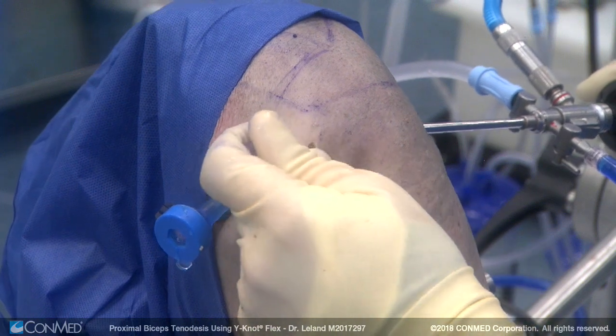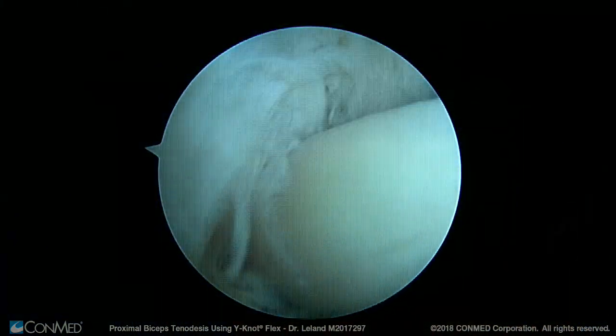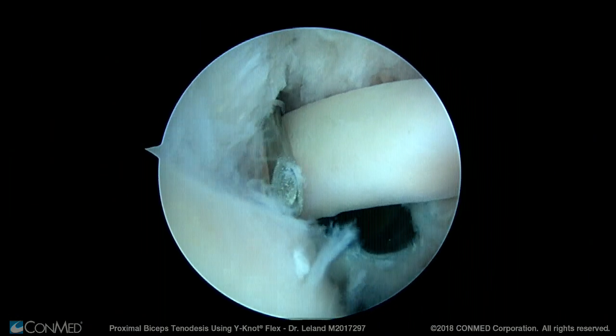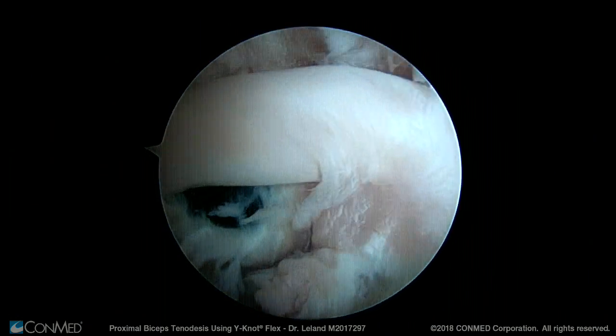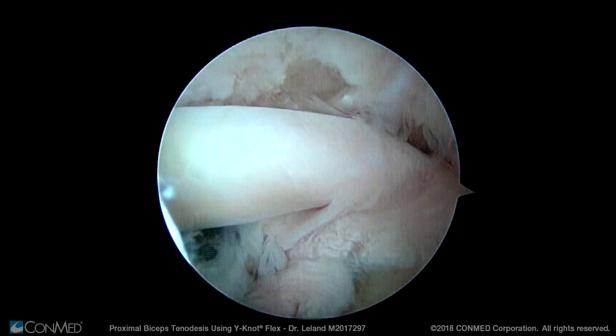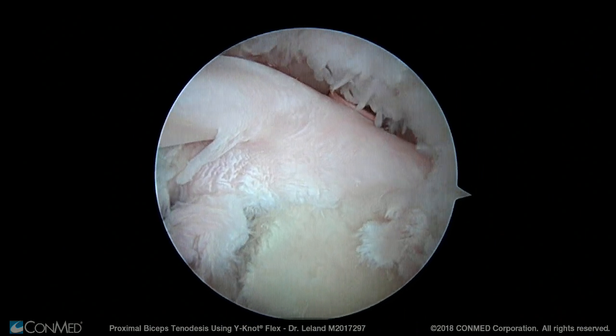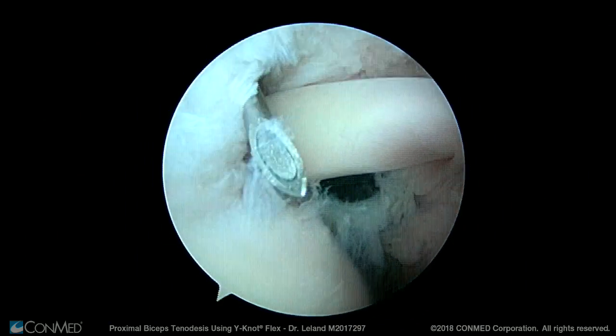We go back to the spinal needle to make easy identification of the biceps tendon from the subacromial space. It is not necessary to pierce the biceps tendon because at this point in the procedure the biceps tendon is still attached to the labrum at the top of the glenoid and we have not yet released the biceps tendon.